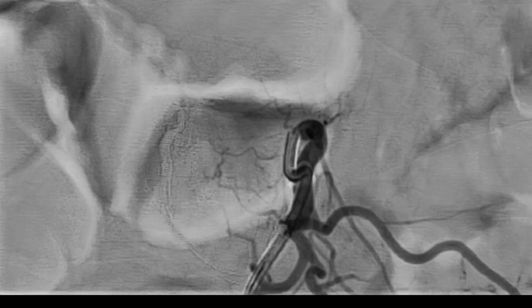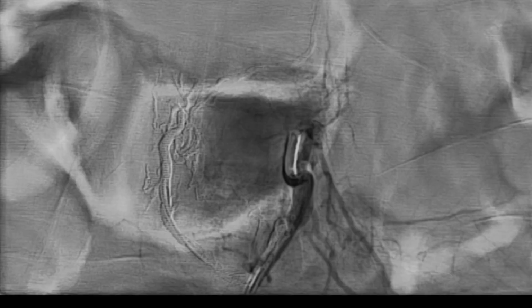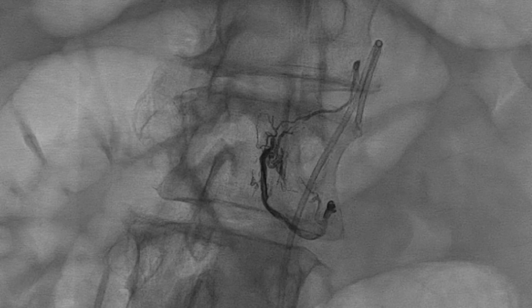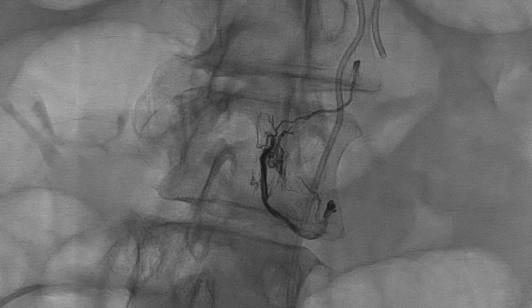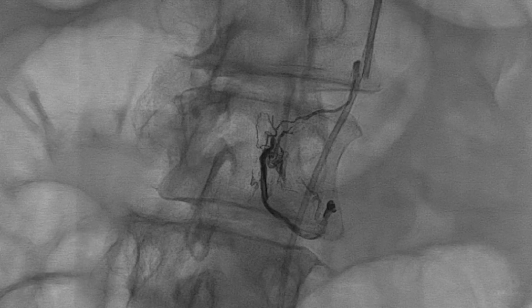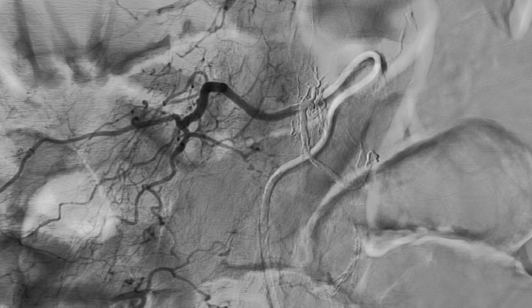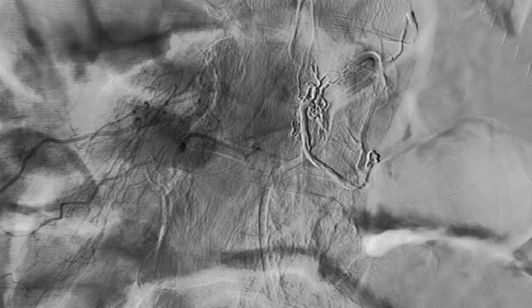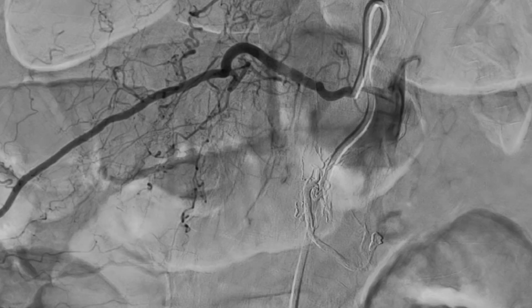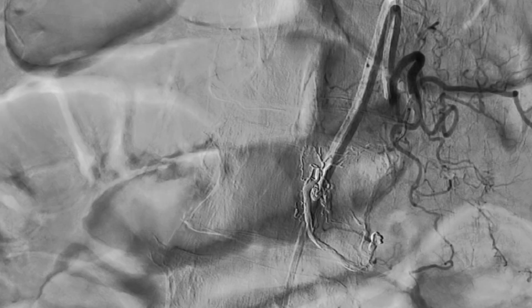We were able to remove the microcatheter, and on subsequent angiography of the left L3 lumbar artery, as well as lumbar arteries above and below the site of the fistula, we did not see any residual filling of the epidural arteriovenous fistula. Following the embolization, the patient had improved ambulation and sensation in the lower extremities and is still undergoing continued follow-up and improvement.